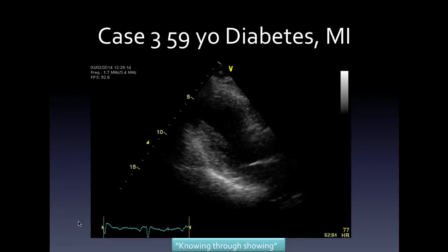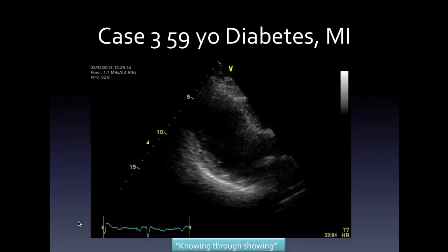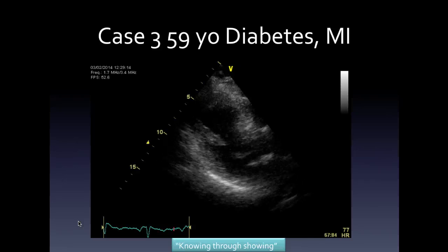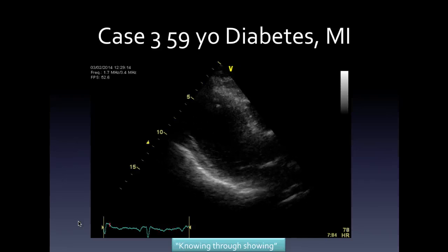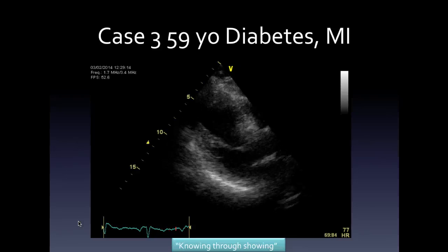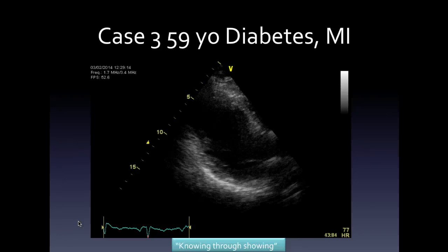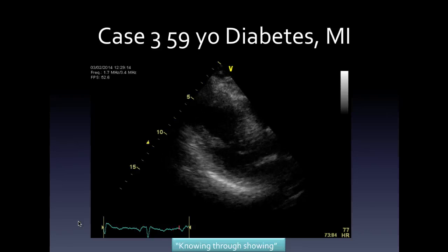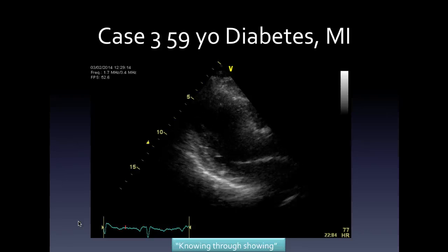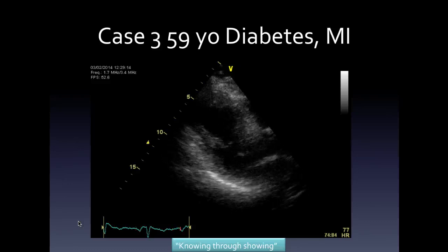He had rising creatinine, impaired hepatic function, congestive cardiac failure with bilateral crepitations, an elevated JVP, a gallop rhythm, and an ECG that showed persistent but probably fixed anteroseptal ST segment elevation. So, as a doctor, you'll know all that. So it then makes interpreting the echo very, very easy. And that's the point I'll make.